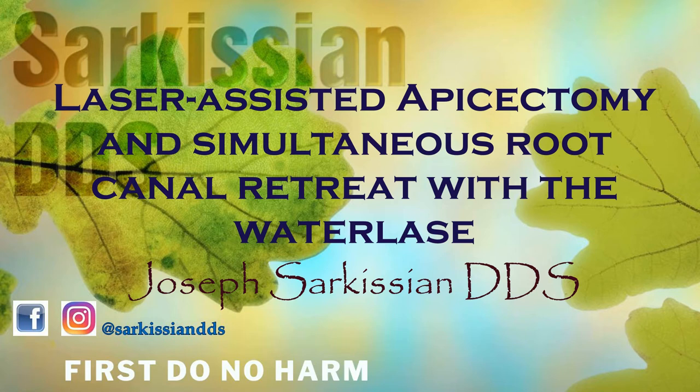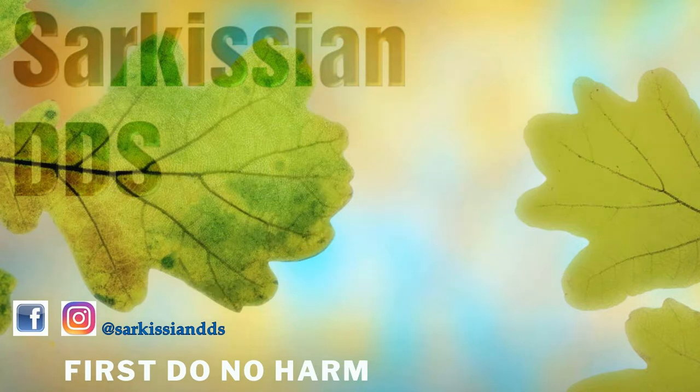This is Dr. Sarkisian. In this video I will feature a wildly interesting surgical topic: a laser-assisted surgery involving the resection of an infected root tip and a simultaneous retreat of the root canal.